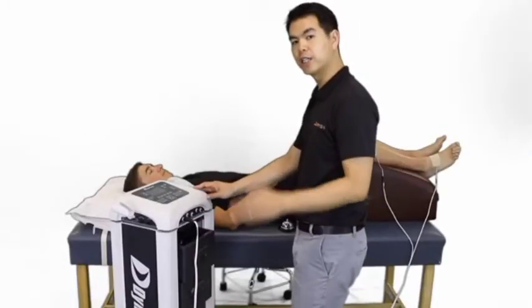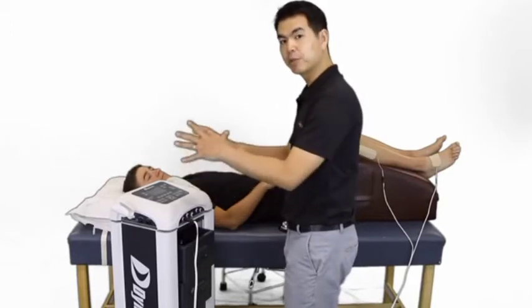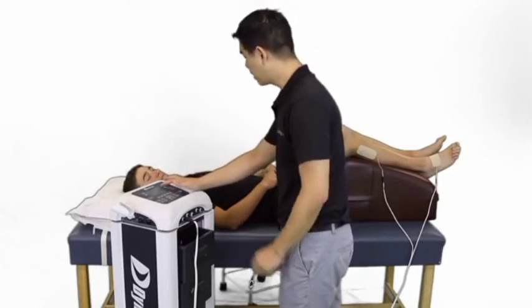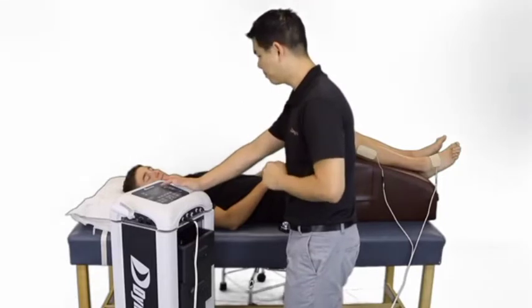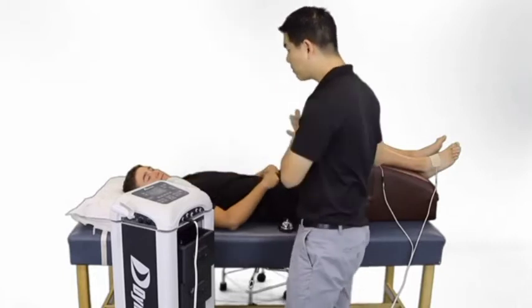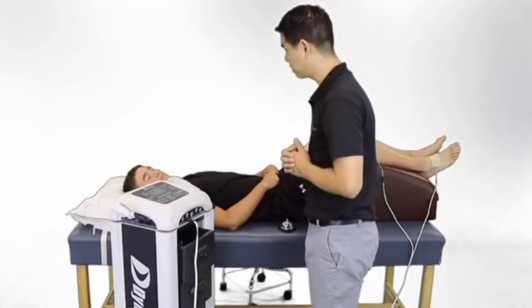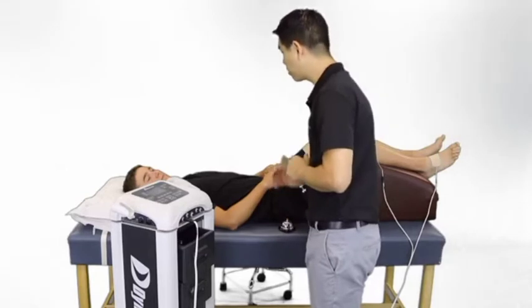The pulse duration is 40 to 100 microseconds. Many times that's preset within the unit. And what we are going to do is, as I add the current, I want you to feel a moderate tingling. Okay? There. Okay, good. You can tolerate that? Mm-hmm. Okay, and we're just going to leave that there for a little bit. We're going to remeasure the swelling and see if it makes any difference. Okay, if at any point in time you need us to stop, make sure you know we have a bell here that you could let us know.